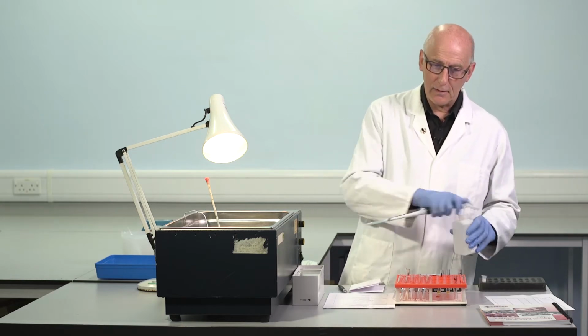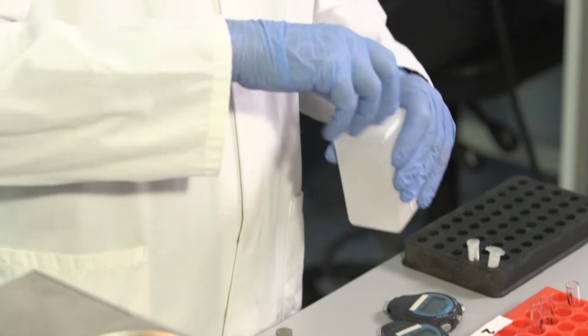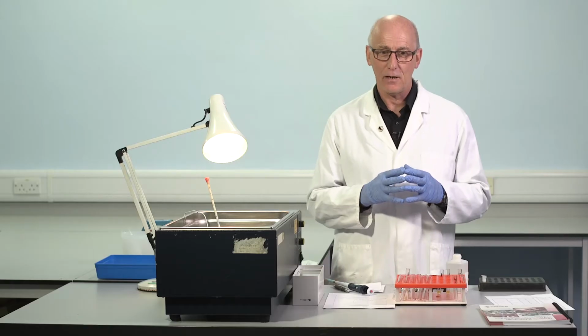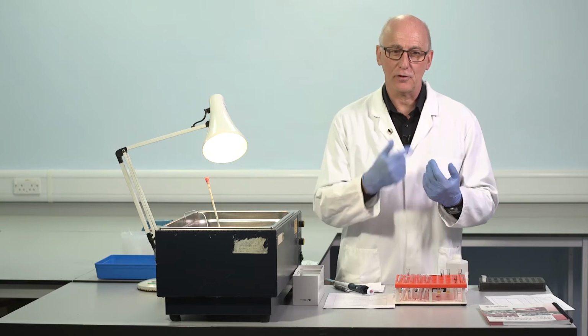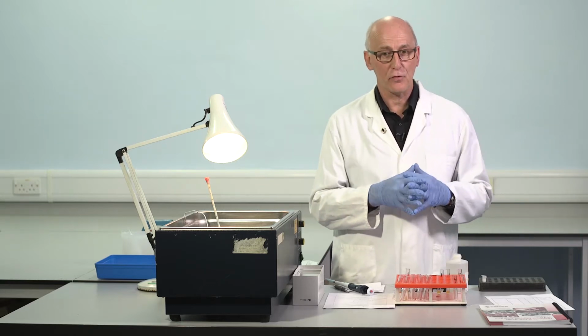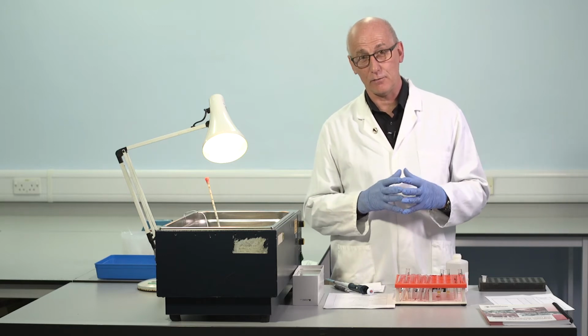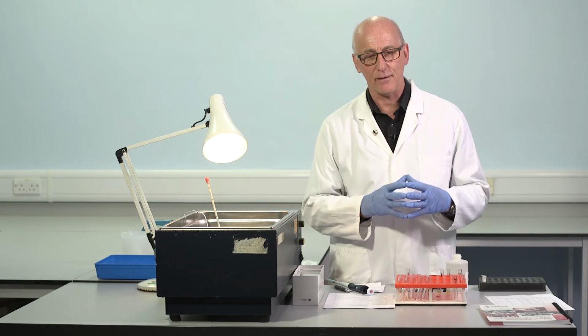It's important that at least 2 of these dilutions are prepared independently. We should not make the first dilution and use this further diluted to construct the other 2. We shouldn't do that. It's bad practice, because if we make a pipetting error into the first dilution, we simply transfer that down the line of dilutions.